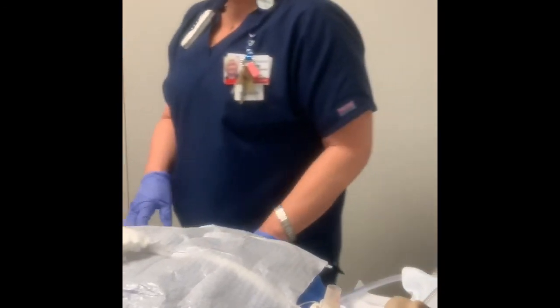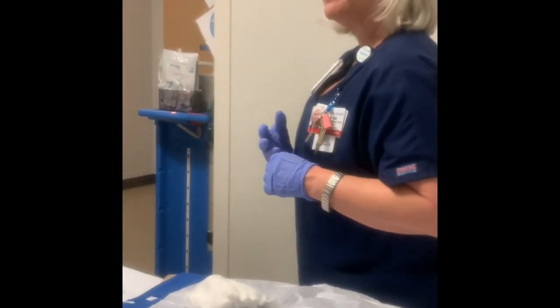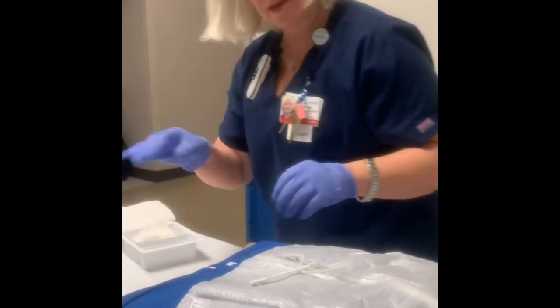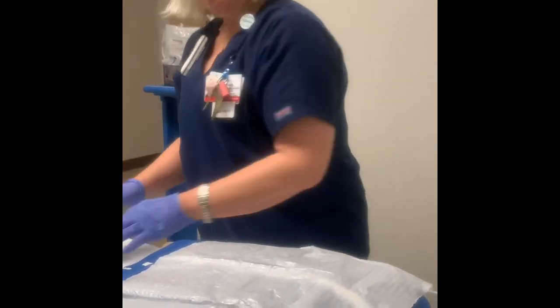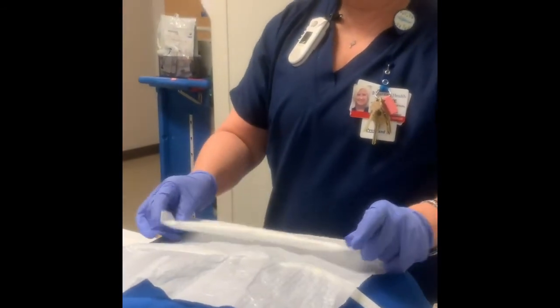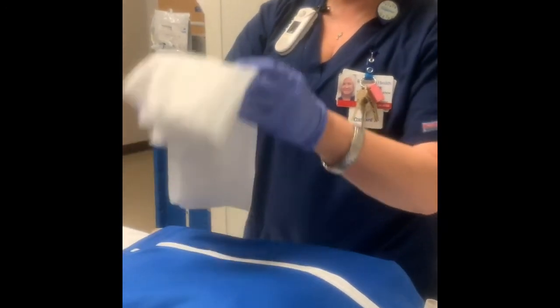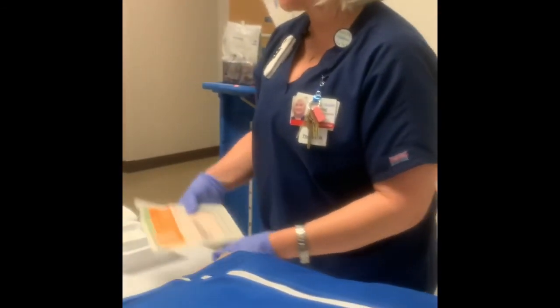So, somebody want to come up and do any trach? Yeah. Can I ask a question about this in general? Uh-huh. So I feel like, are most people walking around with their trach uncapped? I've seen people with it capped before, correct? Yes. So what's the difference? What determines whether they're capped or not capped? Well, it depends where they are along in their, where they are as far as getting their trachs out, etc.